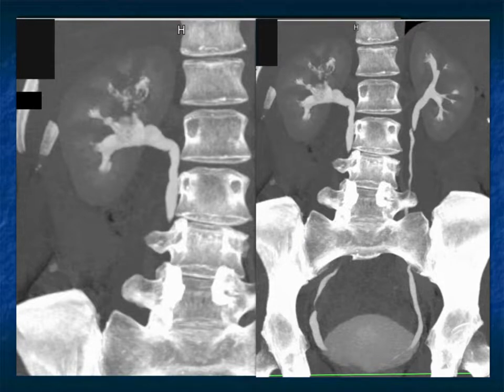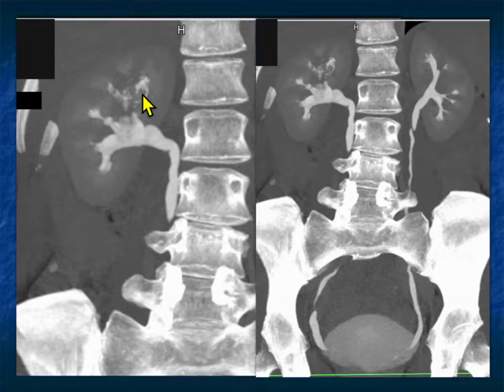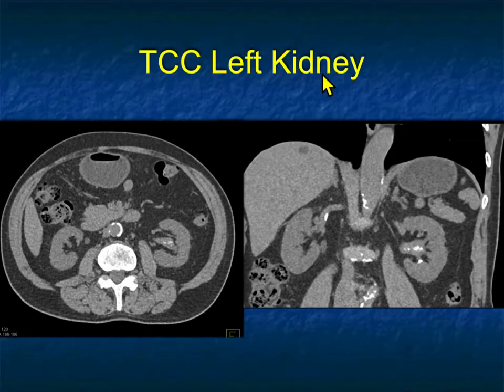On volume rendering and MIP, you can see the pelvis destruction, the calyceal abnormality, and all the extent of involvement very nicely and impressively defined. This is transitional cell carcinoma.